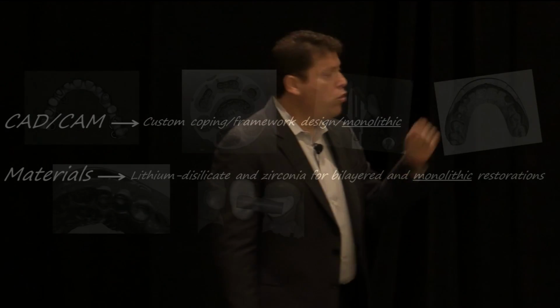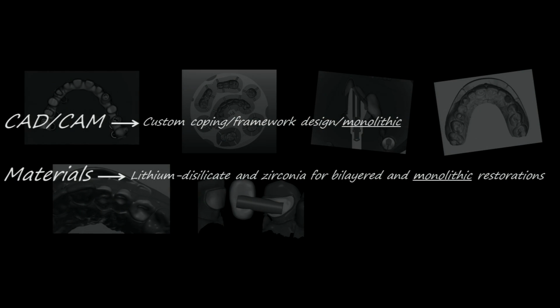Of course, let's not forget implant-supported restorations, custom abutments, screw-retained restorations, which are not part of this section. And the combination of that with the newest ceramic materials such as lithium disilicate and zirconia for both bilayered and monolithic restorations gives us, as restorative dentists, a myriad of opportunities which we really did not have in the past.